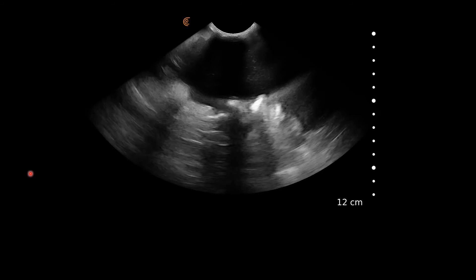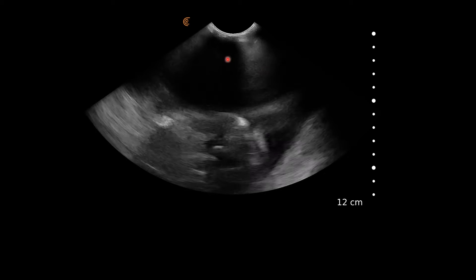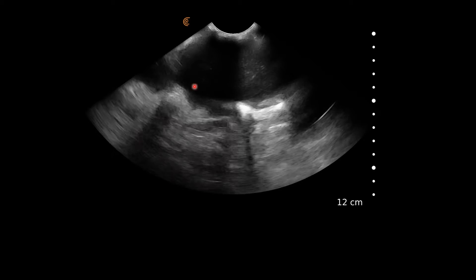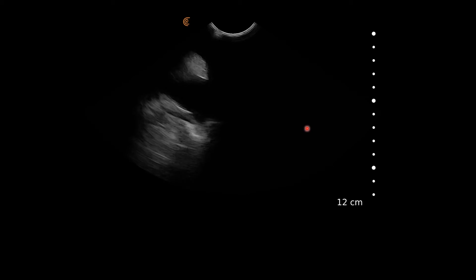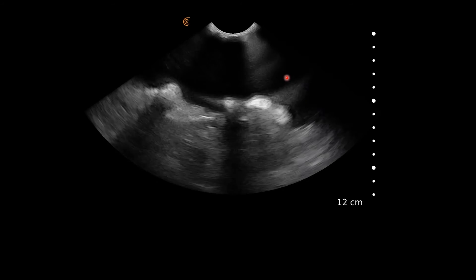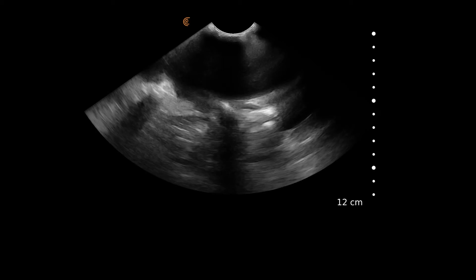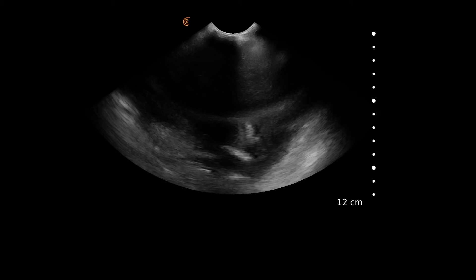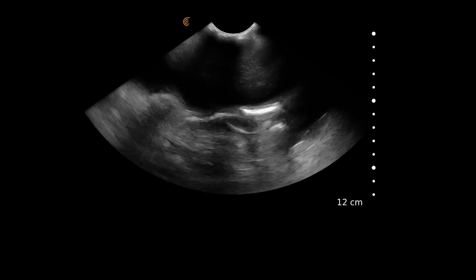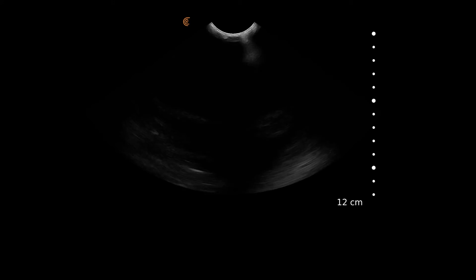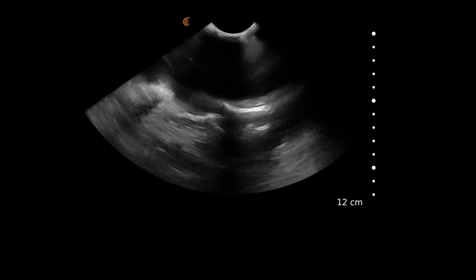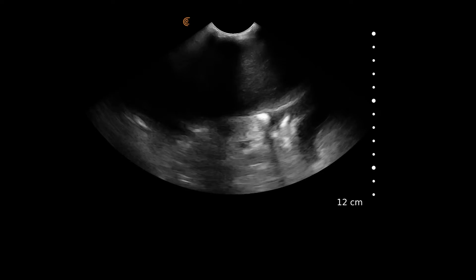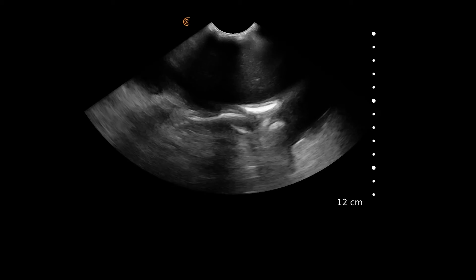On the splenorintestinal view, we can see again large quantities of free fluid within this abdomen. Free fluid within the abdomen can make it harder to find landmarks with ultrasound, can displace organs within the abdomen, and can also make it difficult to apply the pressure we need to see individual organs.